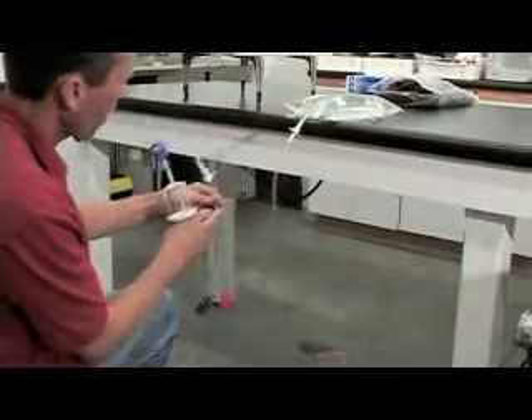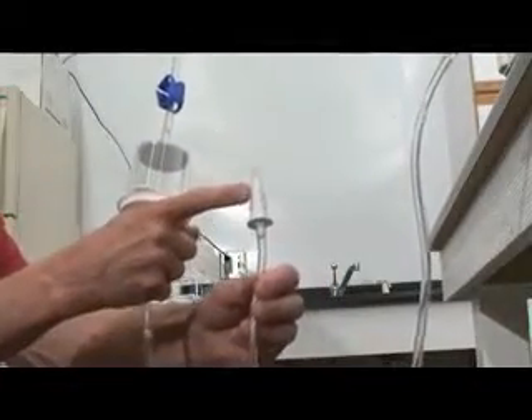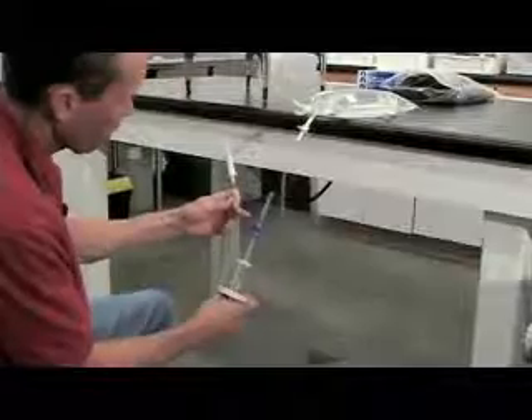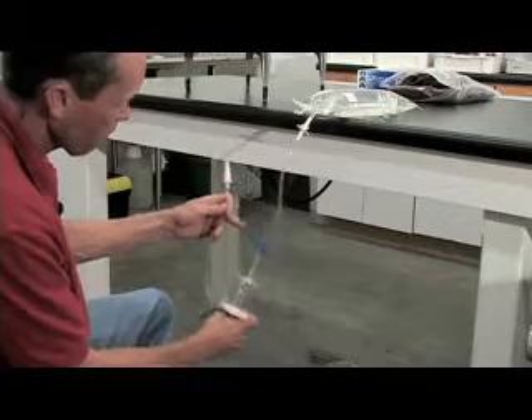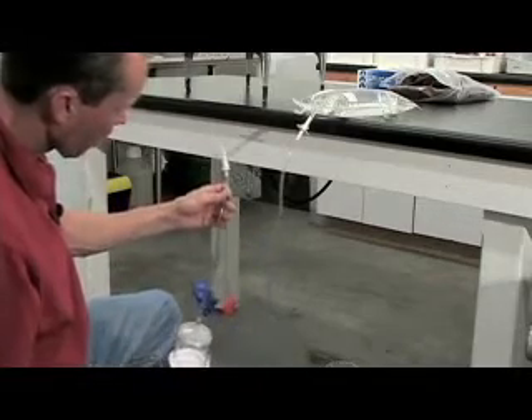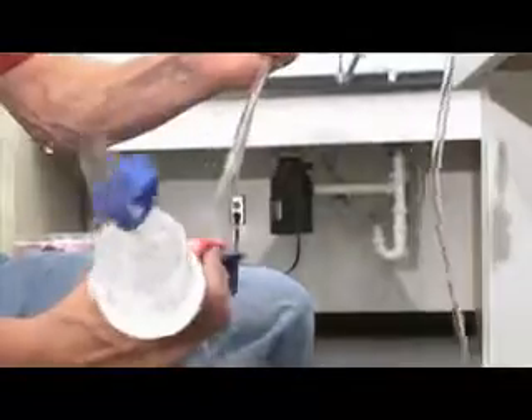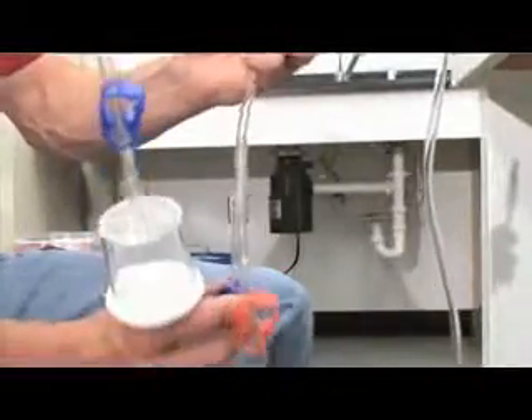Purge air from the Y tubing set and at the same time allow PBS to flow into the filter device until there is a 20 to 30 millimeter depth of PBS in the filter. This is accomplished by opening both tubing pinch clamps, closing off the short tubing section leading to the Foley connector with a hemostat, and opening the pinch clamp on the filter outflow port.